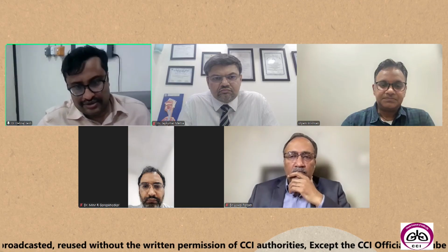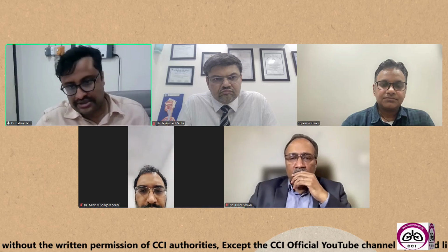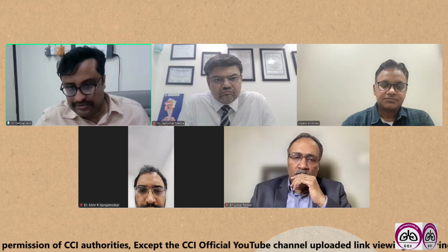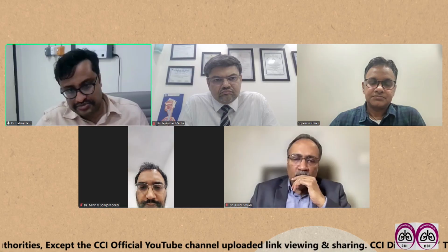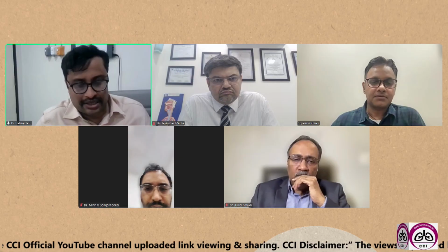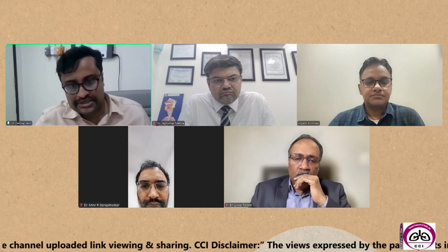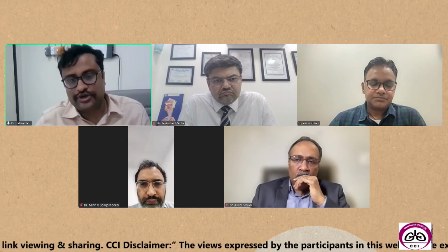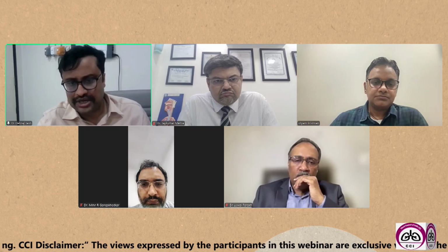In continuation, I will also tell my experience. My training with EBUS was during my postdoctoral traineeship with the Olympus, so I also started with Olympus. Then I joined the initial private hospital where I used to work, and I had the privilege of having the Pentax. And when I used Pentax, although I was much more comfortable with Olympus, I found it very user friendly because, as you rightly pointed out, there are two monitors. You can clearly see, particularly the smaller size nodes also.